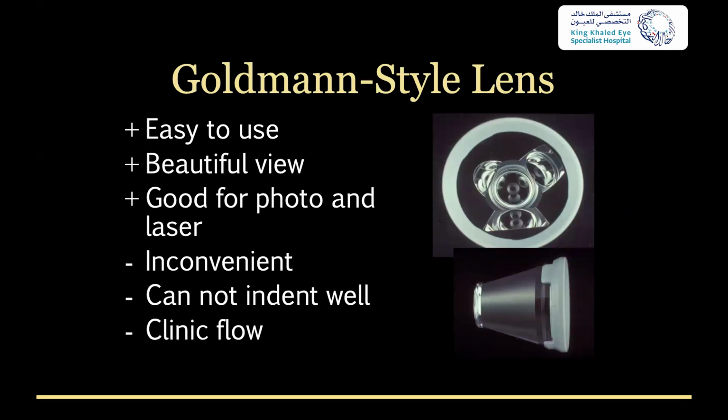So the Goldmann lens compared to the 4-mirror lens is easier to use. The view is beautiful. It's great for photo and laser. Again, it's inconvenient. You can't use it to indent. And it really interrupts your clinic flow.